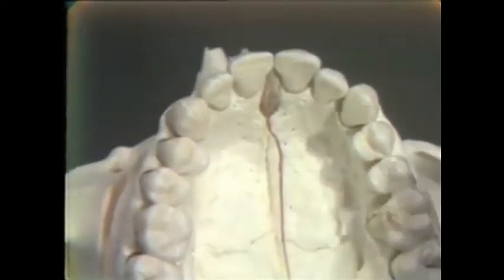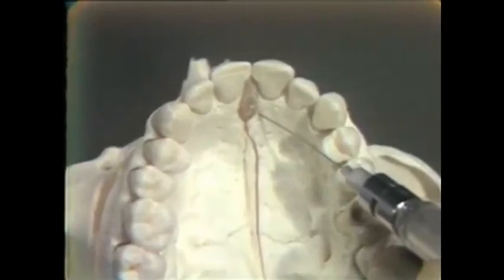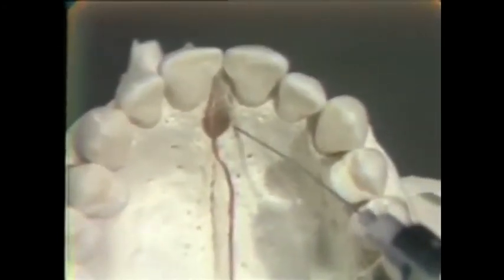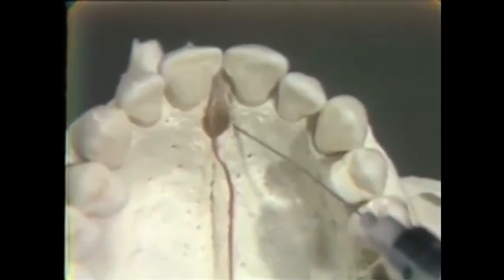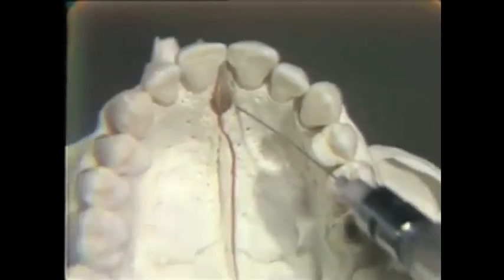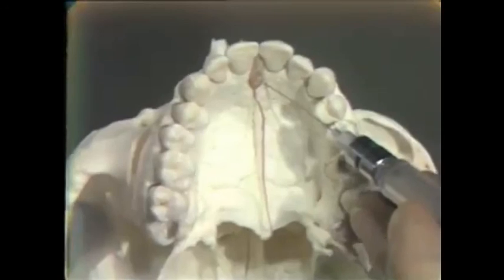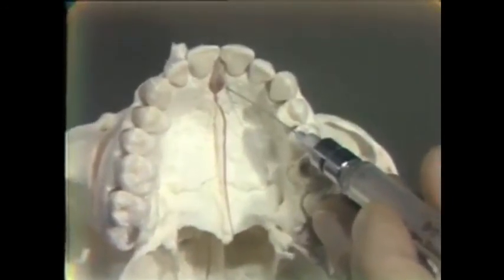So, demonstrating that for us on either side, carried quickly into bone, aspirate, and then again it takes quite a little pressure on the plunger to get some solution out into these fibrous tissues. But again, you will see them blanch as it occurs and know that you've accomplished getting some solution out into those tissues.